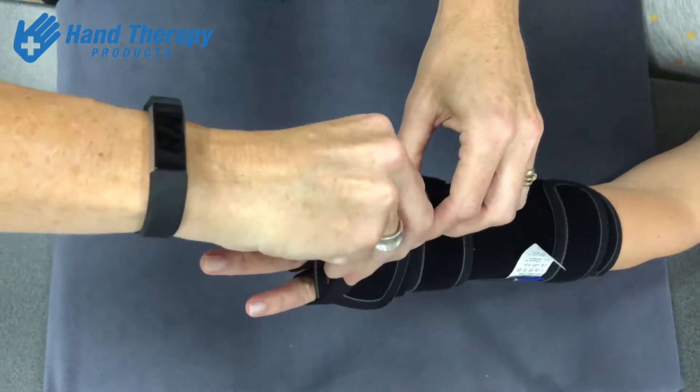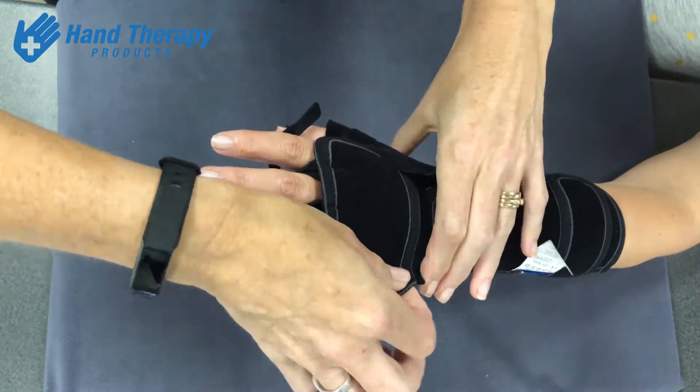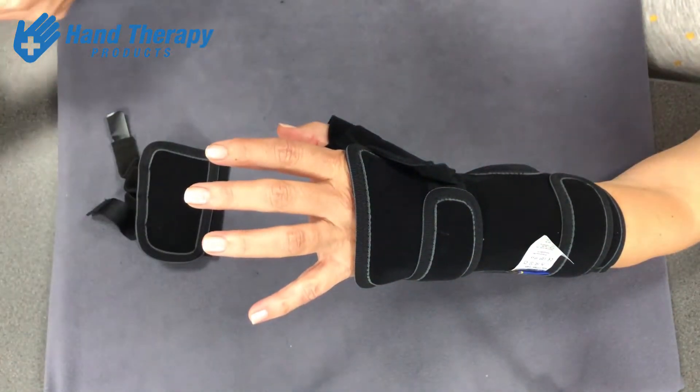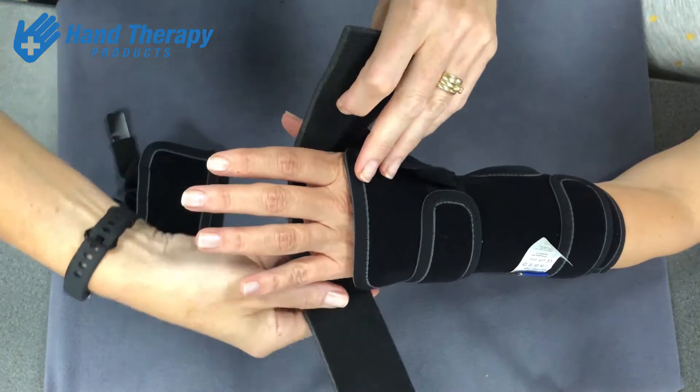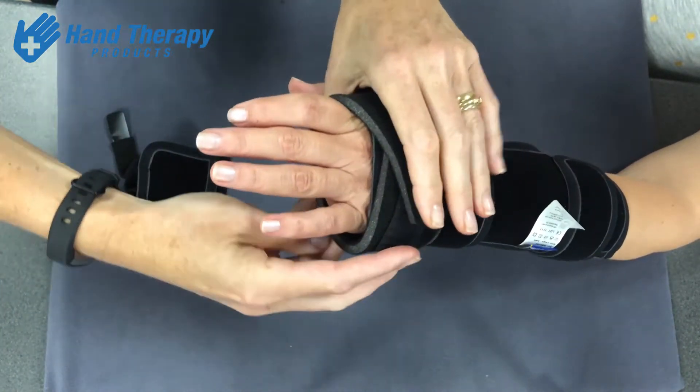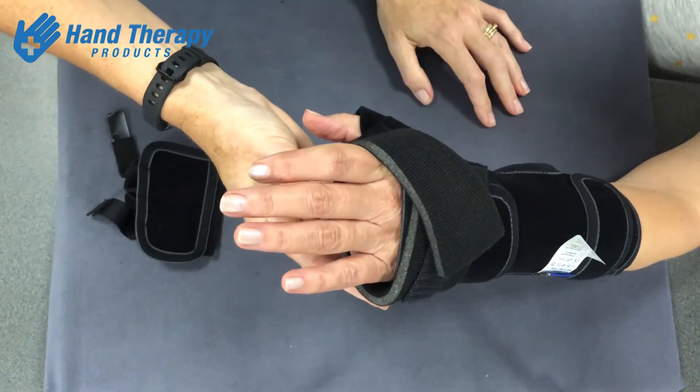There's also an option for night time — if you want to take that bit off, or if you've got a particularly heavy hand and just want to support those MCP joints in extension, you can put the night piece on there just at rest.